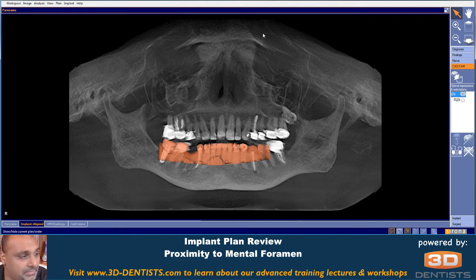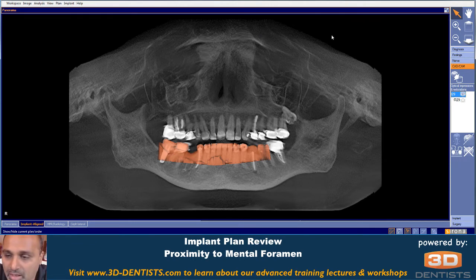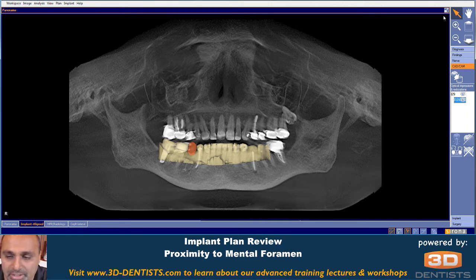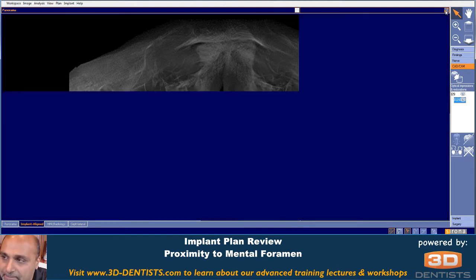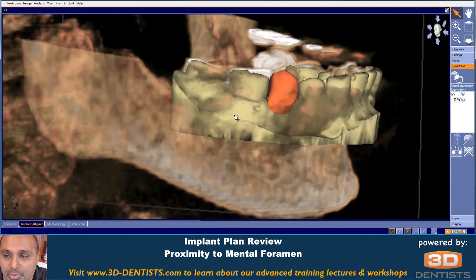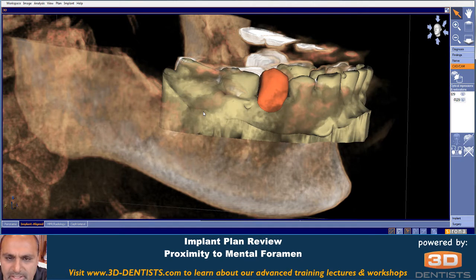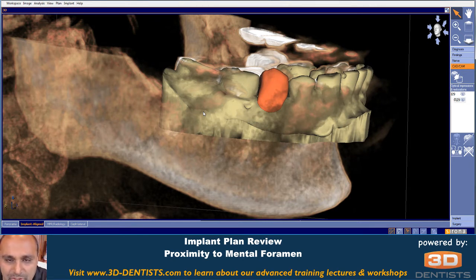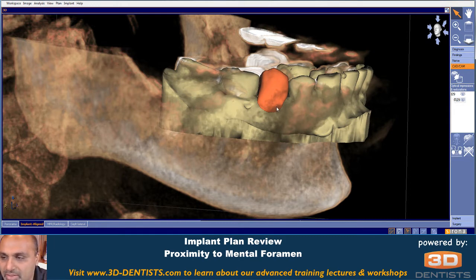The next thing I would look at is whether this is going to be an OptiGuide, DigiGuide, or a CEREC guide. That is honestly going to be dependent on the overall difficulty of the case. If it's in close proximity to vital structures or there's a minimal amount of bone where I need absolute accuracy, I'm always going to opt for an OptiGuide. In situations where I have more than a couple of millimeters of grace, I'll always choose a CEREC guide.